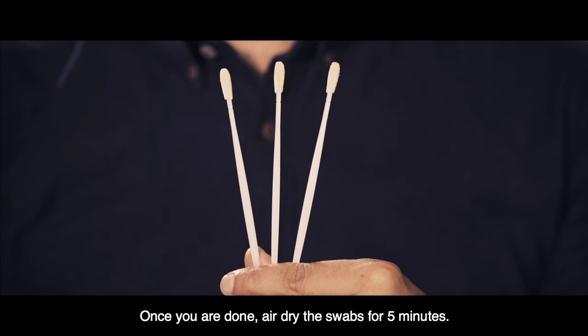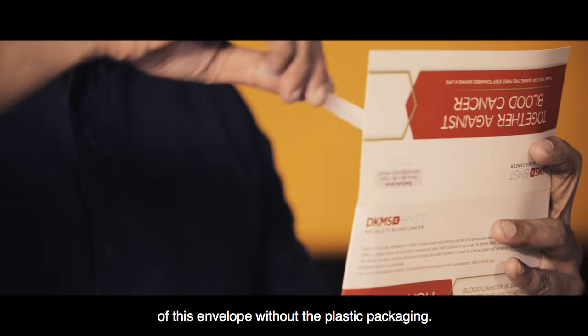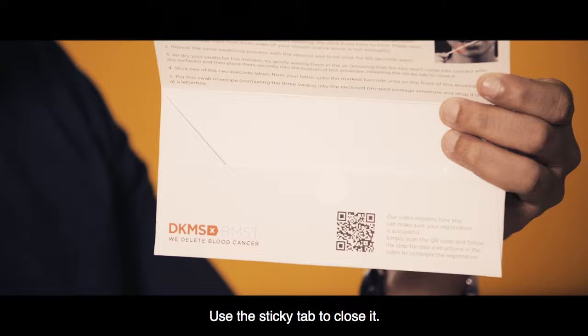Once you are done, air dry the swabs for 5 minutes. Then place them securely into the bottom of this envelope without the plastic packaging. Use the sticky tab to close it.